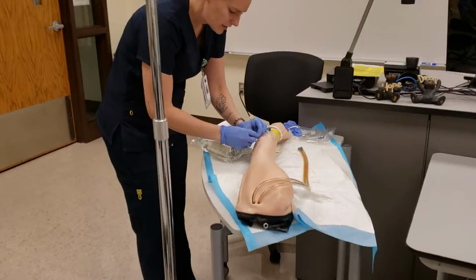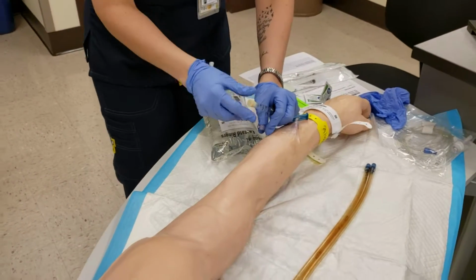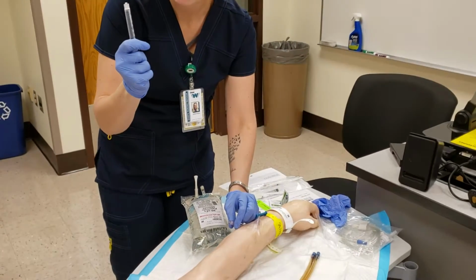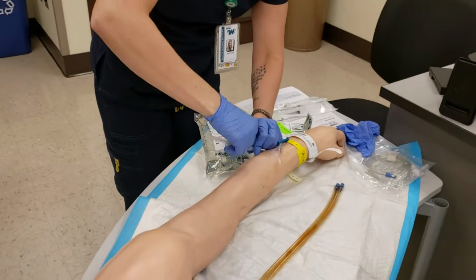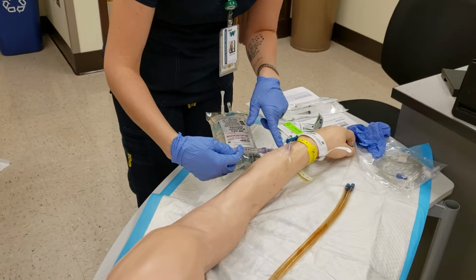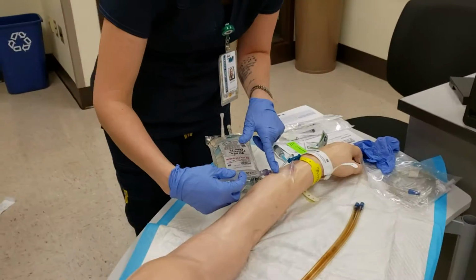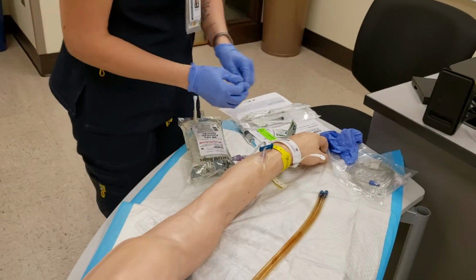Alright, Shirley, so I'm just going to clean this. I would clean this for 30 seconds. I would flush, making sure that the IV site is patent. There's no swelling, no pain with that. Okay, perfect. So then I would discard this.